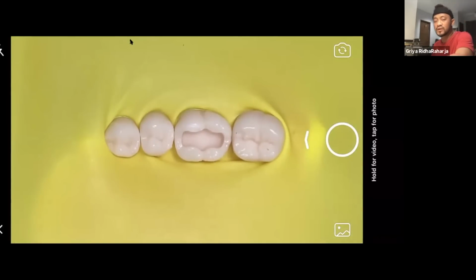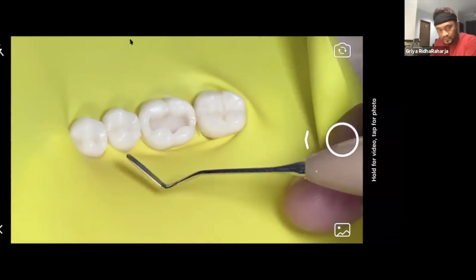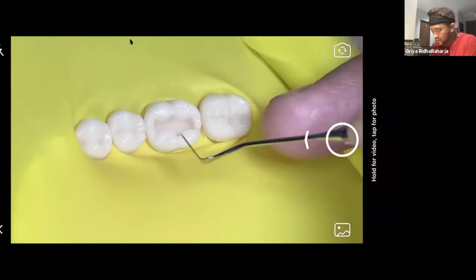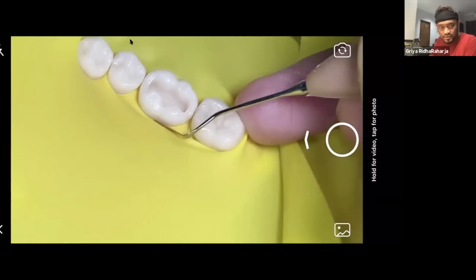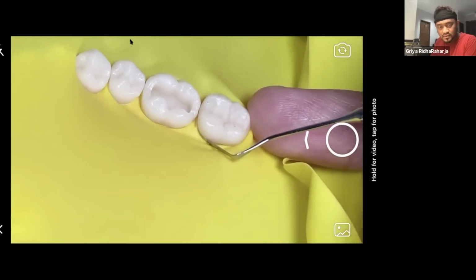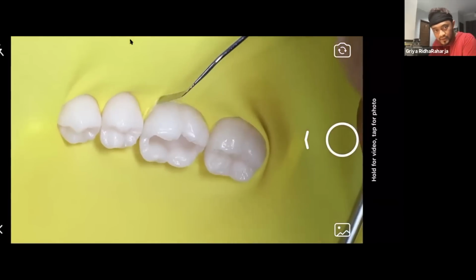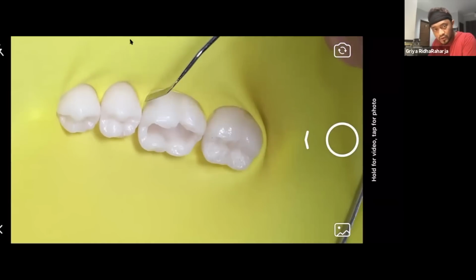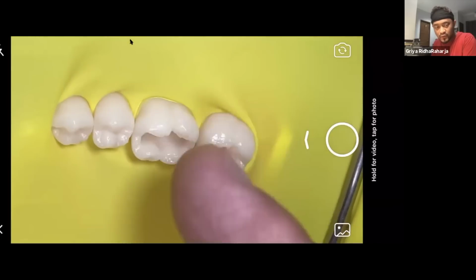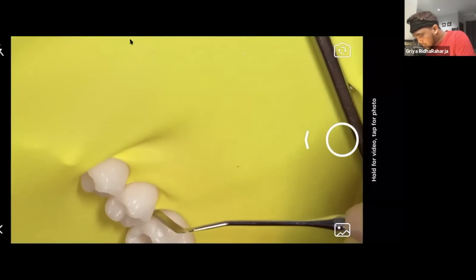Okay. So after this, we need some inversion. You know, you can see this is not good. The rubber dam is not completely moved to the gums. So you need to use your instrument to push gently. If you push so hard, it will harm the gums. Okay. Make sure they are already adapted well. So in this situation, your assistant will make it dry. Use the three-way syringe and dry it. If you have a dry situation, it's very easy to make a good inversion.